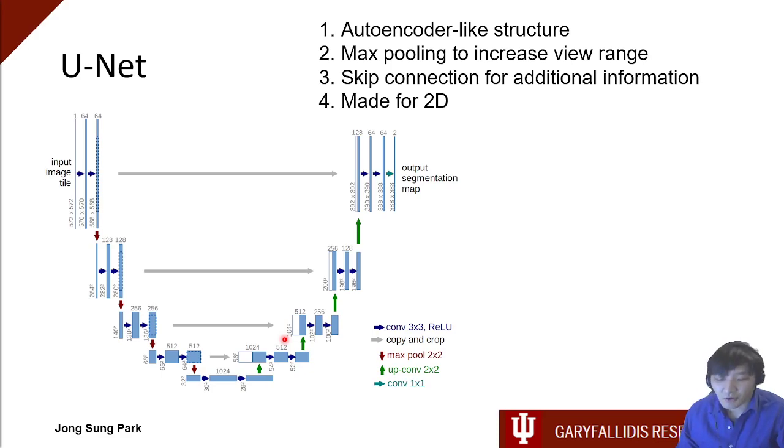So this enables the convolutional layers to learn features of a larger scale. The more we reduce the resolution, the larger the scales each layer would try to learn. So having this max pooling layer reduce the resolution every few layers makes the model learn various types of features rather than just running it through the same resolution for all layers.